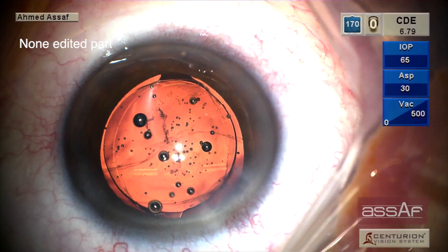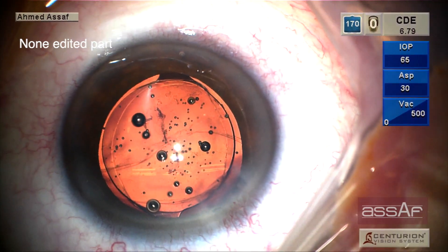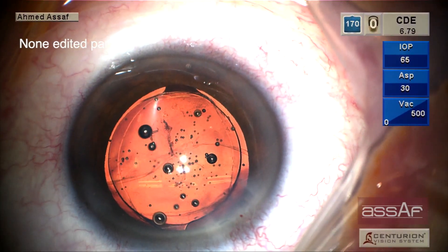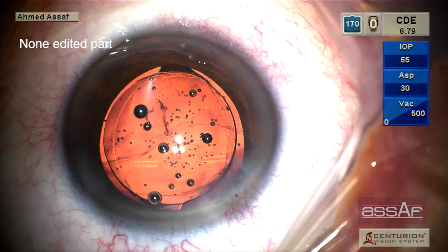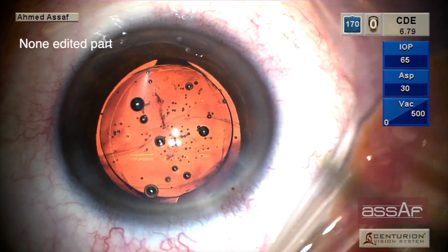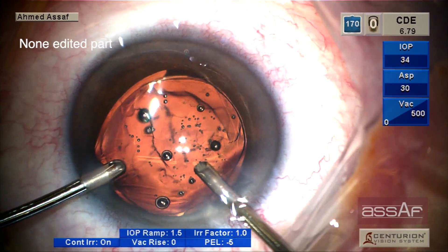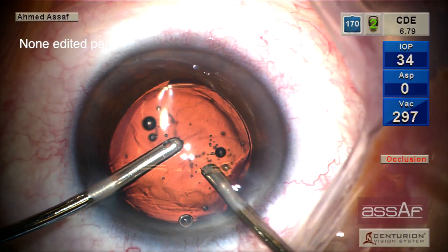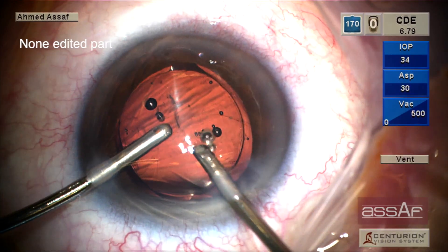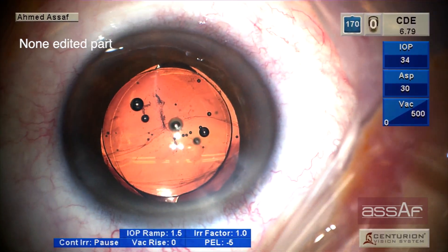This adds extra stability of the single-piece IOL in cases of open posterior capsule. You may argue about the potential chafing of the posterior surface of the iris by the sharp border of the anterior optic lens. However, according to my experience, I have not encountered any case of pigment dispersion after performing the reversed optic capture.